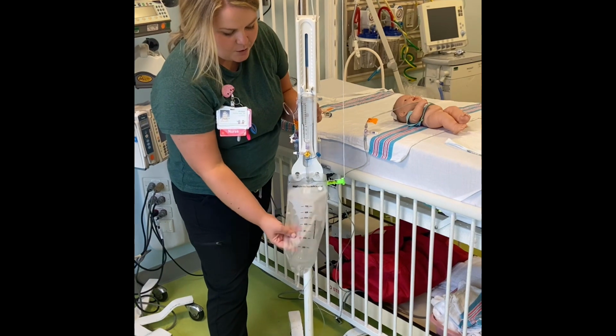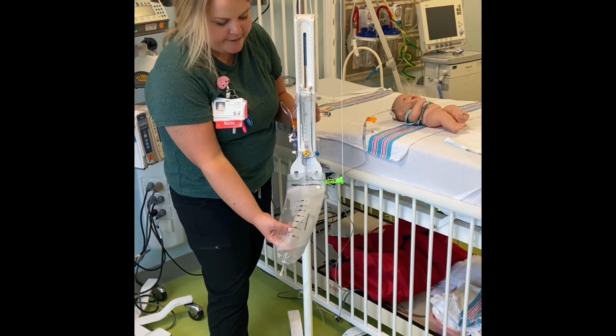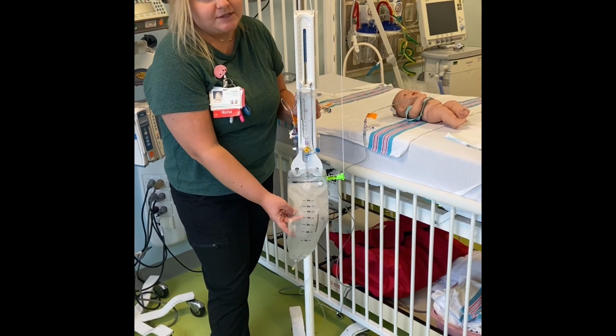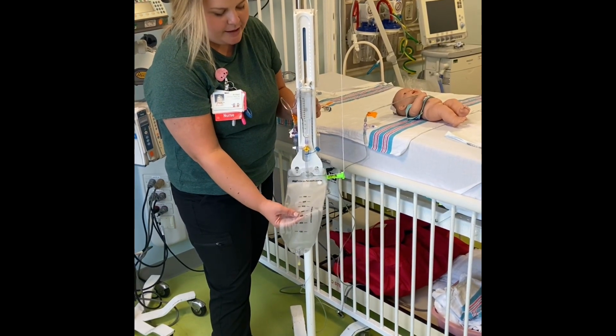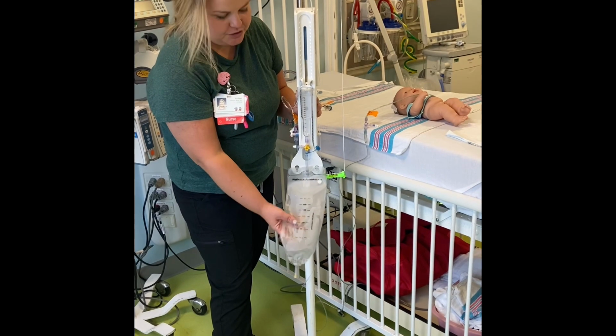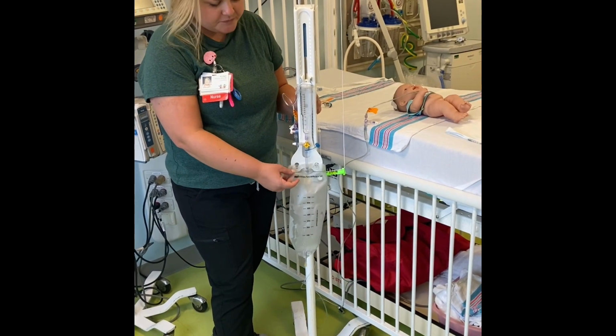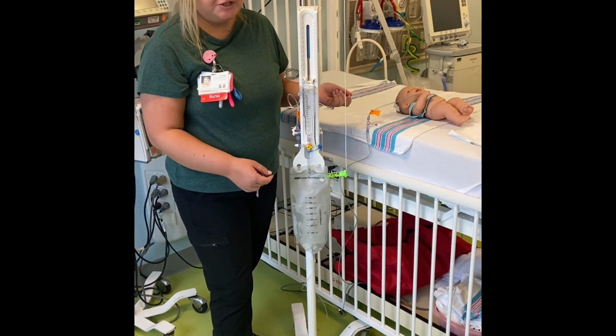Speaking of travel, with your EVD bags, if they're half full or more than that, I would go ahead and change them as well before you're traveling. If you're just staying put in your patient's room, once they get to about 3/4 full, you want to change them as well. So now I'm going to show you how you would change the bag.